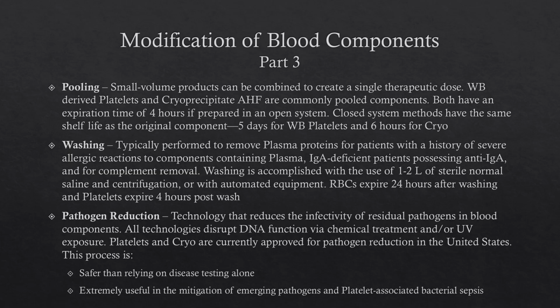But in either case, basically, no matter what the pathogen reduction technology is, there's the addition of a chemical and then usually illumination with UV to disrupt the DNA in either a traditional pathogen or perhaps some emerging pathogen that's not even on the radar yet.